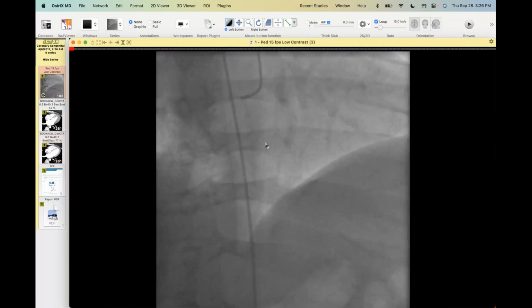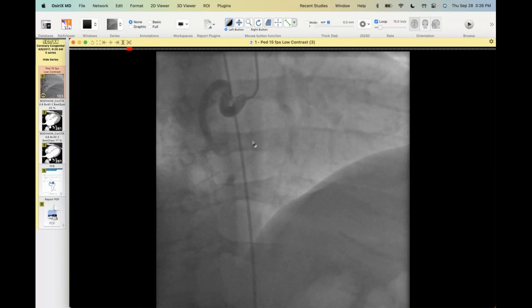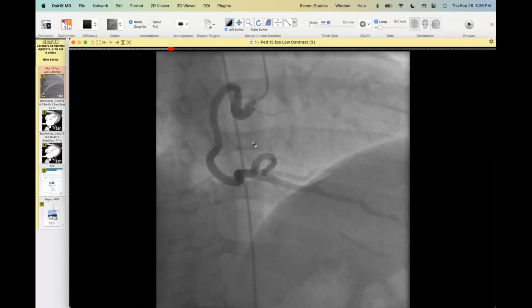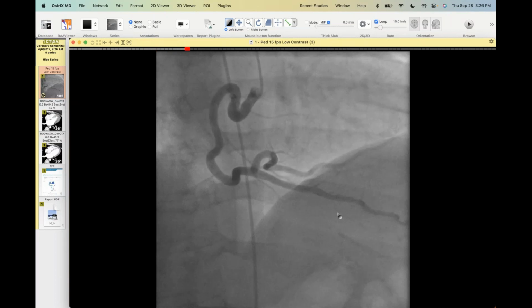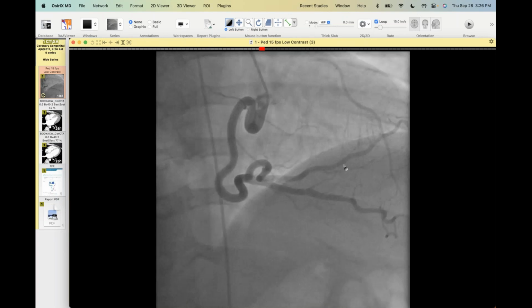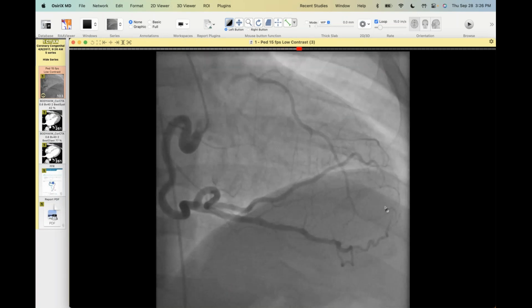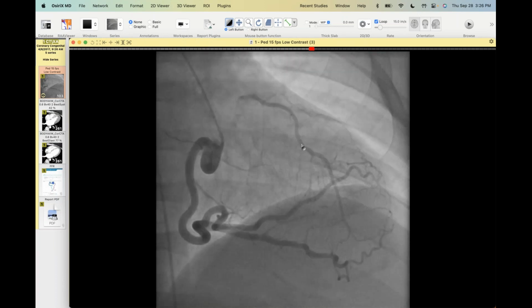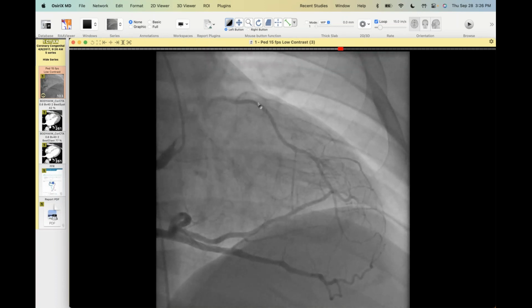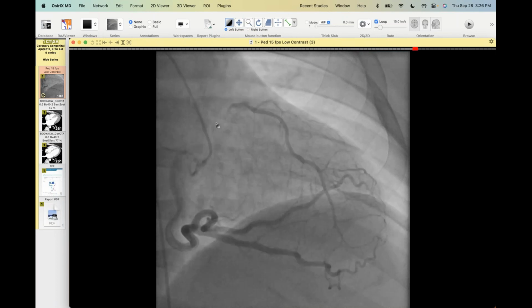At the cath, they were unable to find the left coronary artery. So this is the right coronary artery injection, and you can see filling of the PDA, and they swoop around here. And posterolateral, it looks like that's probably the posterolateral branch, and then some wraparound into the LAD. And then this is the LAD that essentially blindly ends right here. And you can see a little bit of filling of the circ right there.